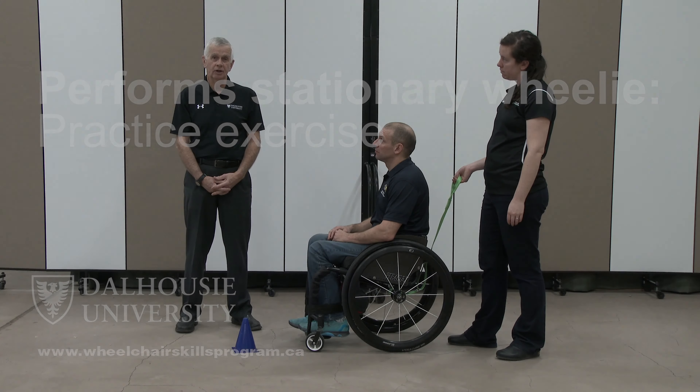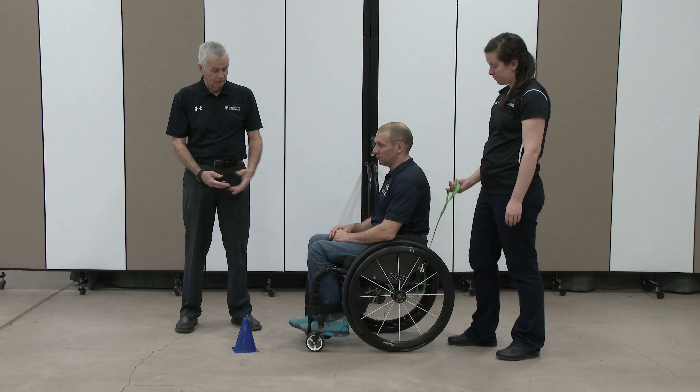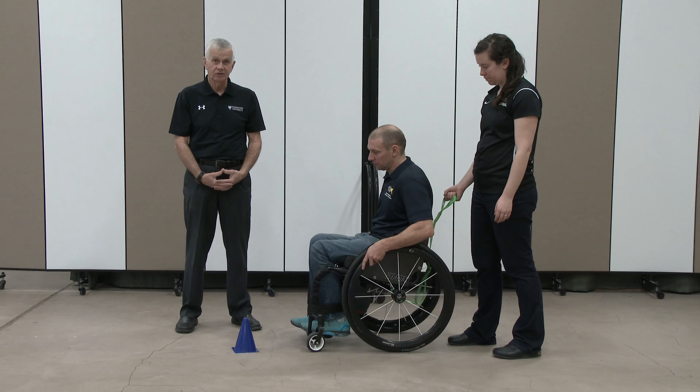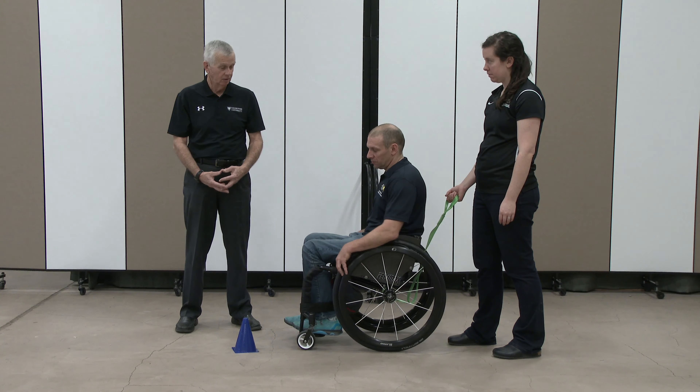As a variation with the stationary wheelie, to help the person understand the effect of their body position, we'll sometimes do a little game whereby we're asking a person to put their caster up on top of an obstacle like this pylon.